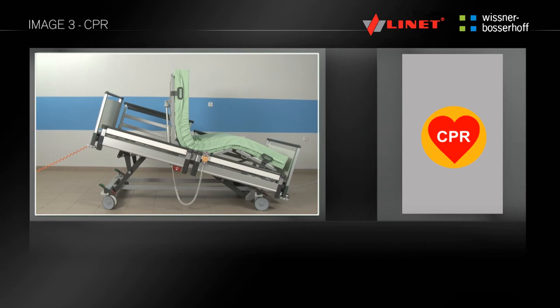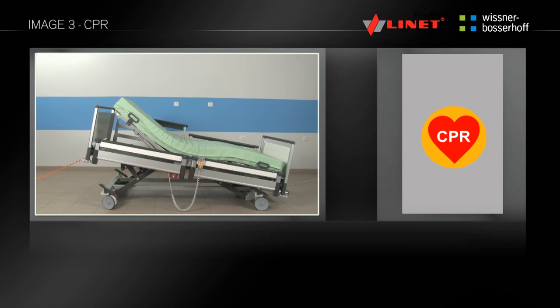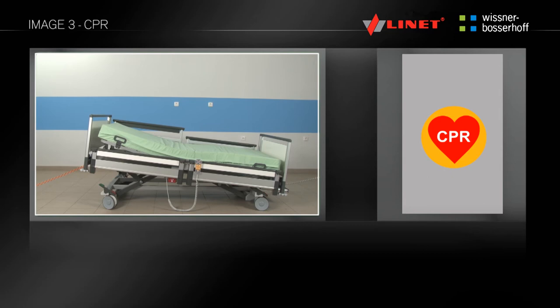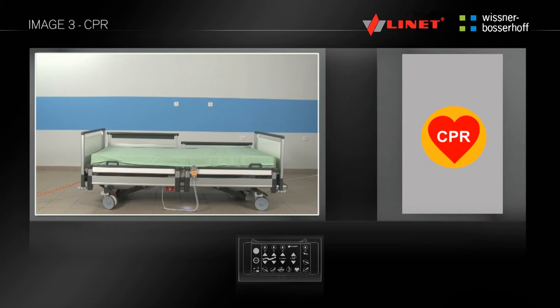By pressing and holding the CPR button, you can activate this function. With this function, you do not need to use the activation go button. The CPR function will flatten the mattress platform while moving to the lowest position to allow for resuscitation. This function can be set on the supervisor control panel in the area of pre-programmed functions. When necessary, you can also set the CPR position mechanically.